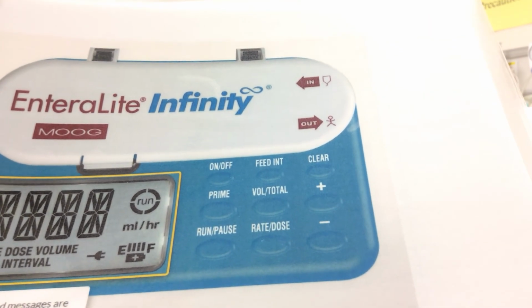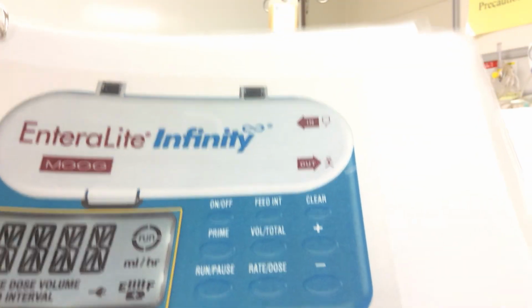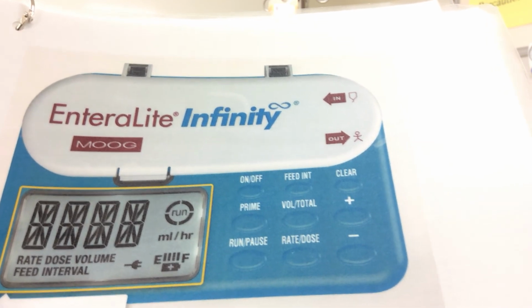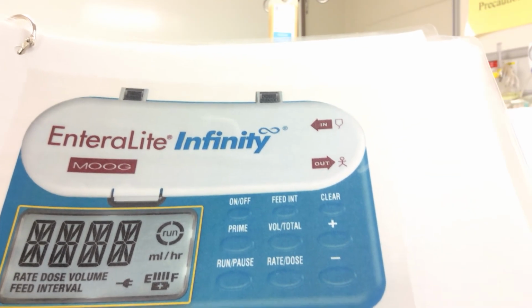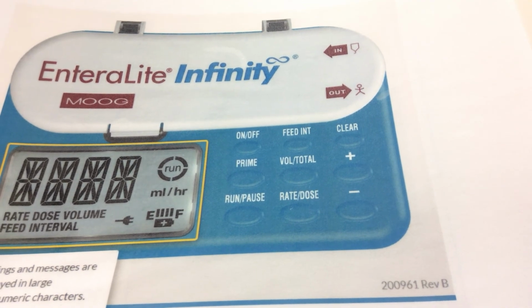So I'm going to pretend 200 mLs has been infused. I'm going to write that down on my paper, and then I'm going to hit the clear button. That way, at the next assessment, whether it be the oncoming nurse or later on in my shift, I know how much tube feed they have gotten between the time I cleared it and documented it until the next time I clear and document it. So we will help you get comfortable with these pumps over in the clinical setting.